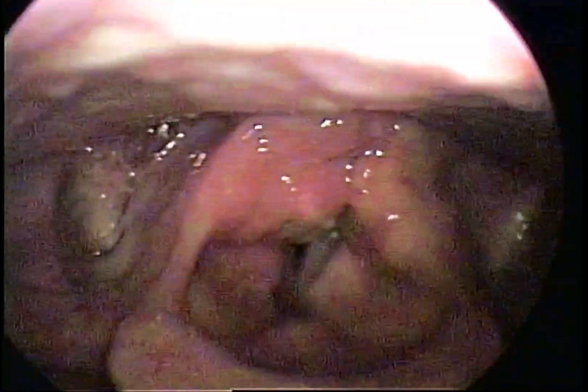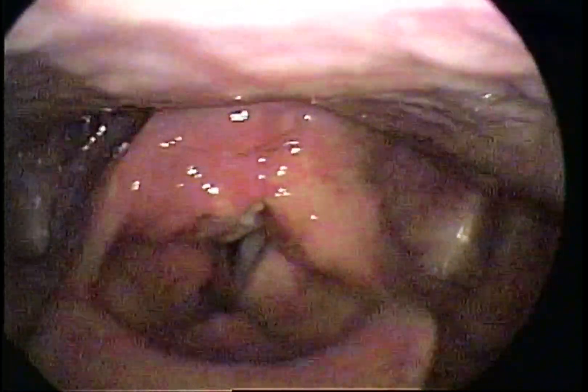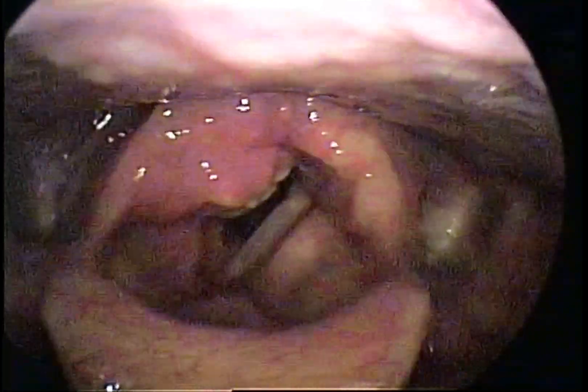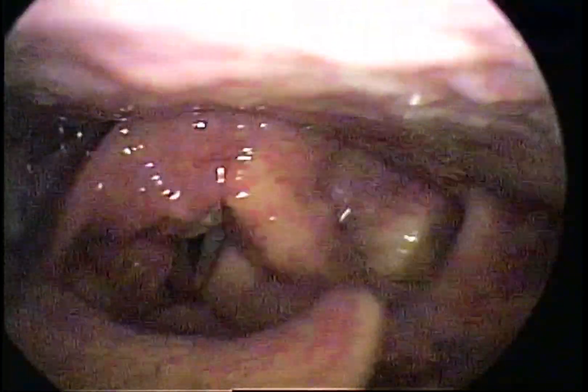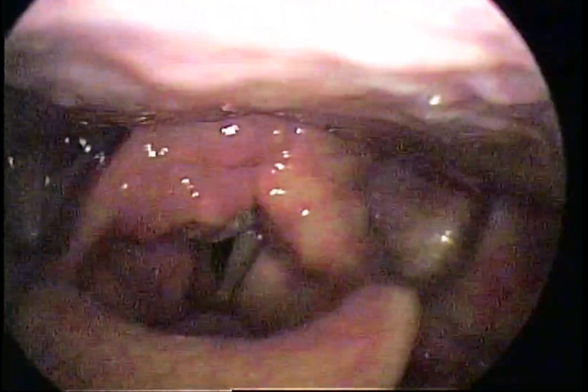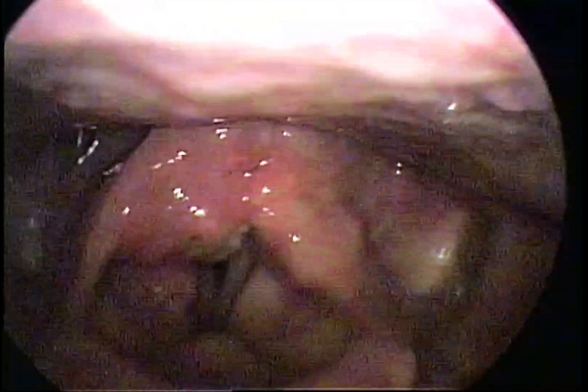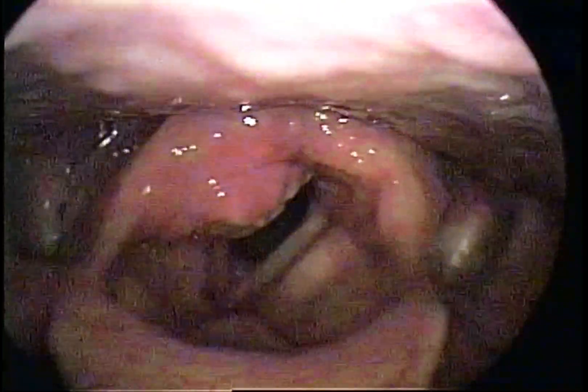The right uppermost part of the voice box is swollen and has a whitish red area. This is cancer of the larynx.